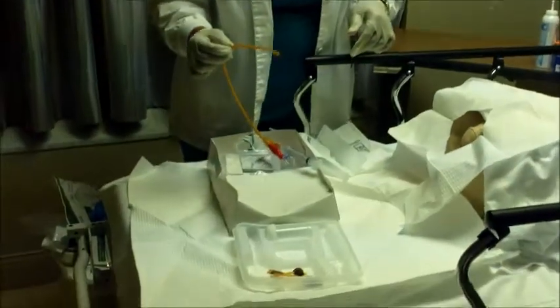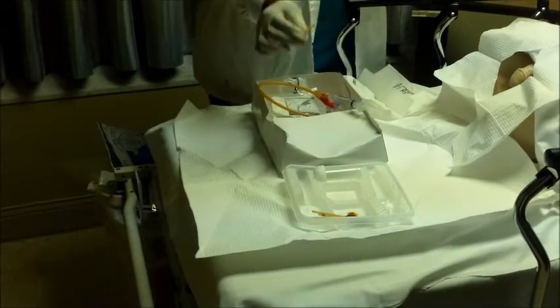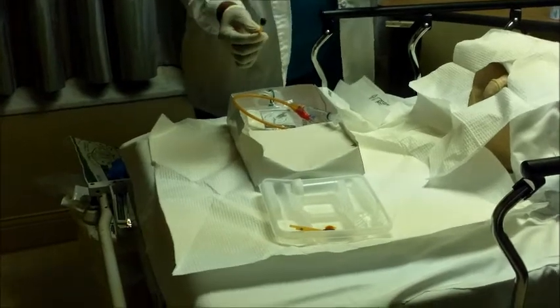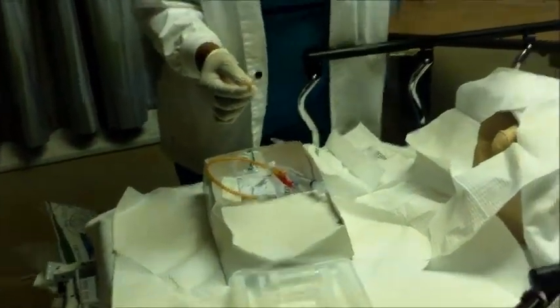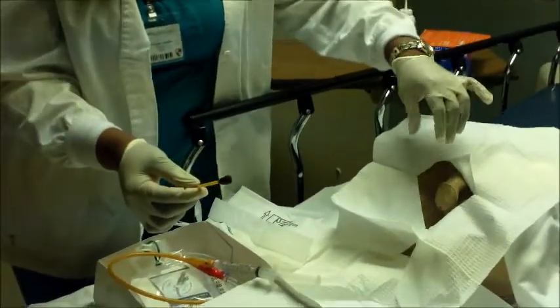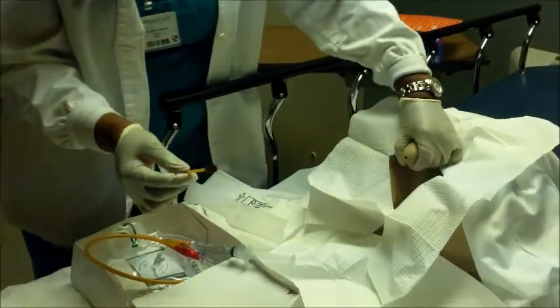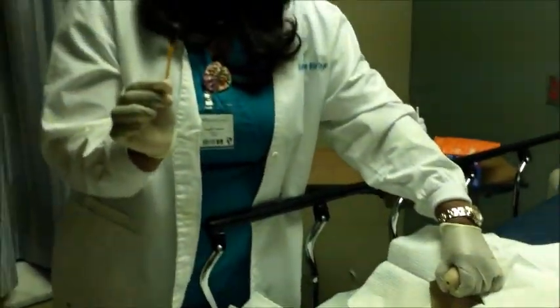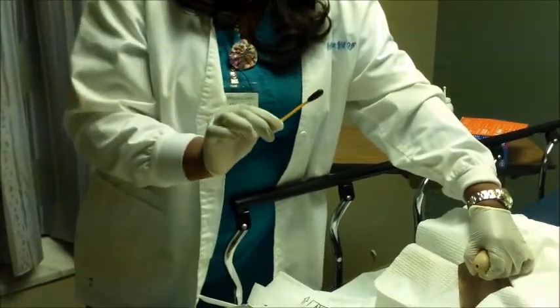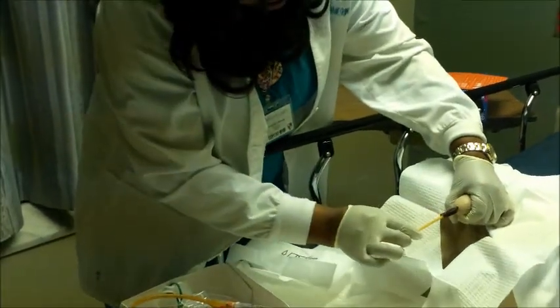Now I'm going to let my patient know that the betadine may be a little cool because we're at room temperature. I want to make sure that my hand will become dirty because I'm going to use my left hand to hold his penis. I'm going to wrap my pinky around my thumb, and now I want to take the betadine swab and clean the urethra opening, doing a circle of rings around to clean the whole head. And start here.